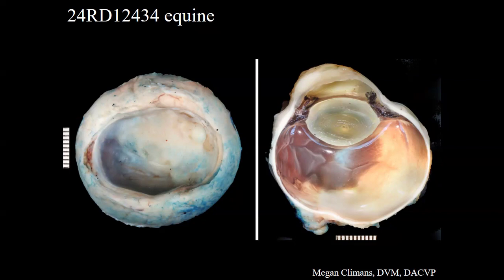So okay, the next case, which is actually very apropos, given Jamie's second case. Wait, we're going to do the gross and the history first. So this is a 12-year-old pony gelding. So we have a horse. This is the left eye, which, there's lots of descriptions of normals, and then the abnormal: a pink tan raised mass, suspect a certain diagnosis, which I will withhold for a second, expanding and invading 3/4 of the cornea.